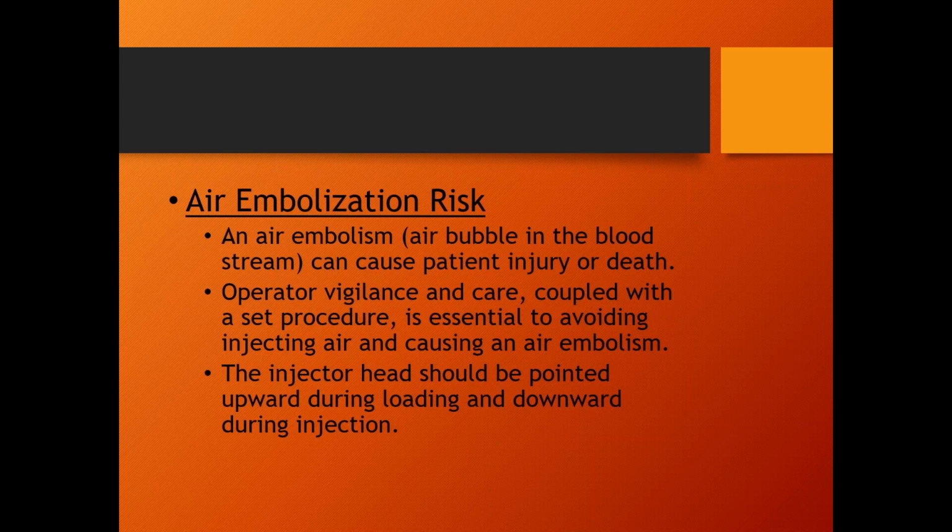Embolism risk. Obviously, we're injecting fluid into a patient, so we're going to do that usually with an IV needle. It can be done with a catheter, but there's not really air embolization risk with a catheter so much. But the systems are set up so that whenever you fill the syringe up with a fill tube, this is my fill tube right here.